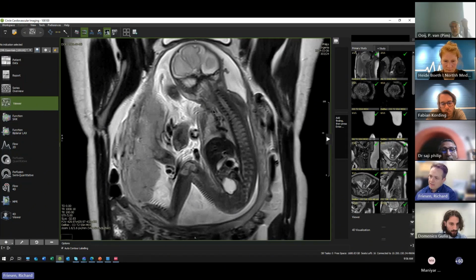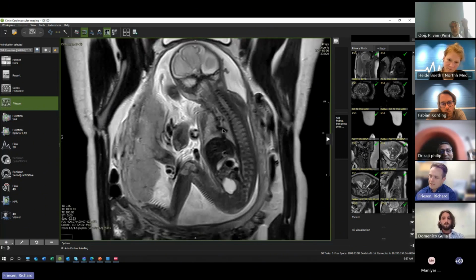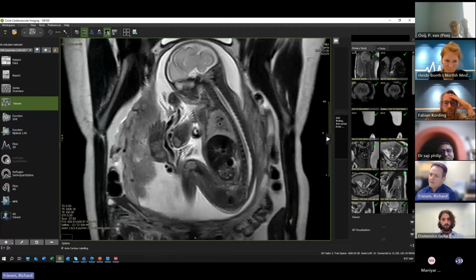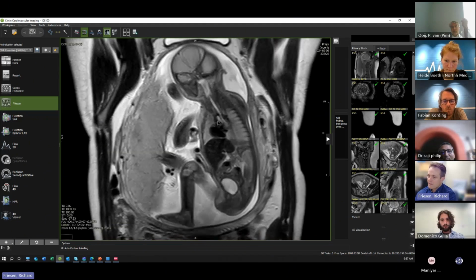And again, looking at the cardiac anatomy, we see the diaphragm here. We are a little bit more rightward in the baby. We see these dilated and engorged veins in the region of the right lower pulmonary vein. A little bit more smaller vessels going from posterior to anterior towards the SVC, which may be representative of a typical azygous vein, but there are a few other vessels in there, and this particular one that is dilated in the region of what may be an upper pulmonary vein coming back in towards the SVC itself.